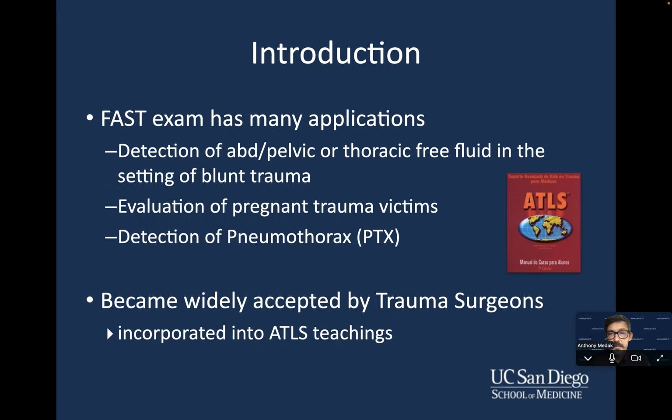The FAST exam has many applications, but primarily it revolves around the world of trauma. And in fact, this particular technique for decades has been widely embraced by clinicians from all different specialties and has been incorporated for many, many years into the Advanced Trauma Life Support teaching by the American College of Surgeons, as well as widely accepted and used by emergency physicians, anesthesiologists, and on and on and on.